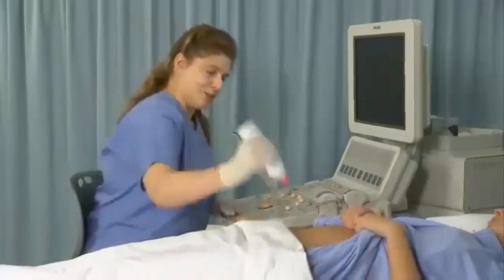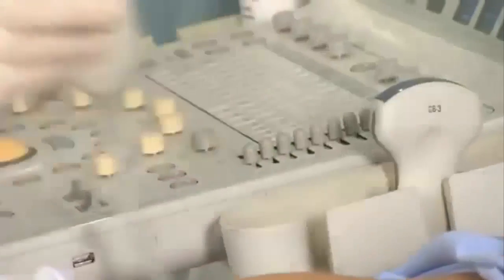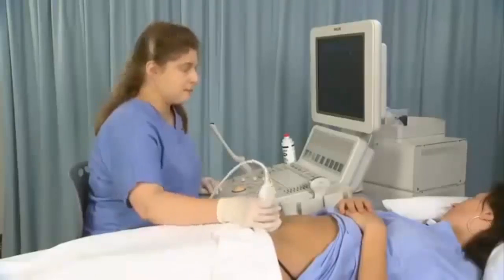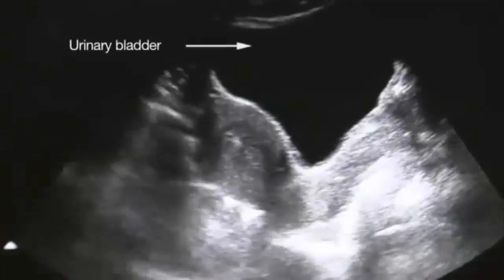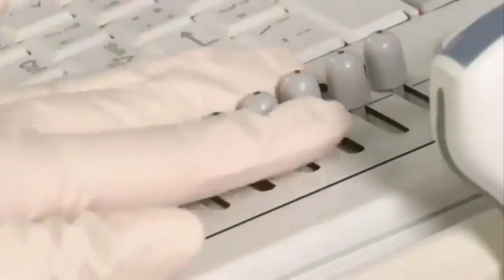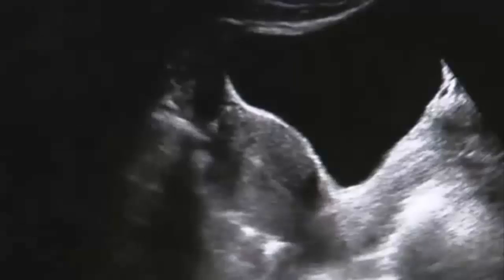Expose the patient's abdomen and apply gel on the midline just above the symphysis pubis. Start the transabdominal examination of the uterus by performing a survey scan of the pelvic organs using the full bladder as an acoustic window. Make the necessary adjustments to the machine parameters to maximize image quality.